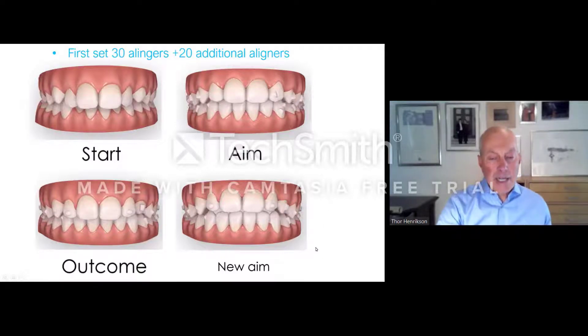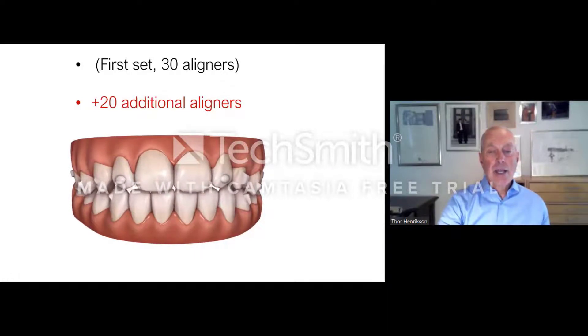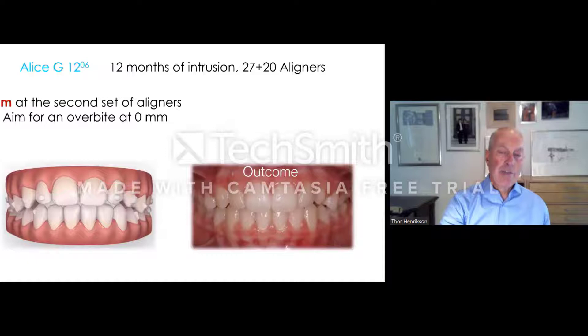During the second set of aligners I made a new ClinCheck, and this was the aim. I aim at an overbite at zero millimeters. We are addressing just the four incisors and also trying to derotate tooth 23. The first set had 30 aligners, then we have an additional 20 aligners — totally 50. So this is after 12 months of treatment. This is the aim after the second set of aligners and this is the outcome, and now it starts to look quite okay.